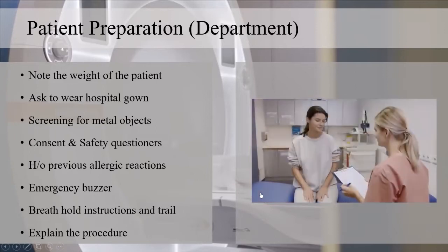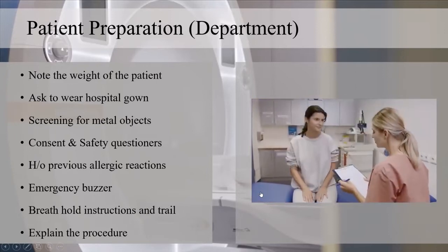Next, we have to take a consent. The consent should be written and informed, and explained nicely to the patient. And safety questions will be asked about things like the history of any previous allergic reactions or surgeries, etc.